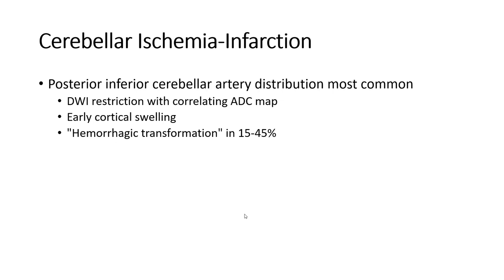The first differential analysis is cerebellar ischemia/infarction. The most common distribution is the posterior inferior cerebellar artery territory. On DWI, there is restricted diffusion with corresponding ADC low signal. Early cortical swelling is seen, with hemorrhagic transformation occurring in 15–45% of cases.